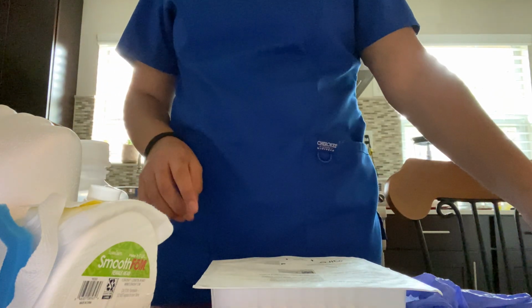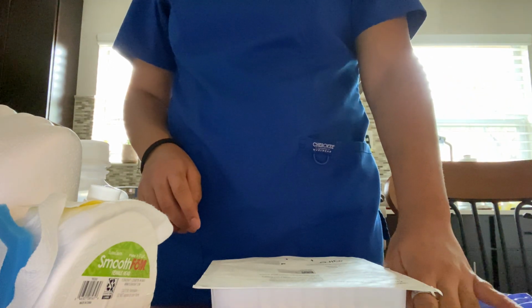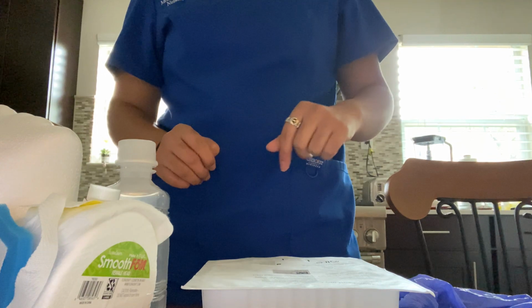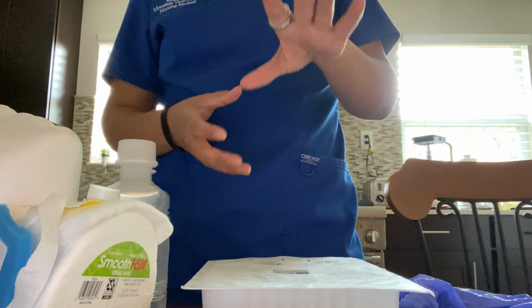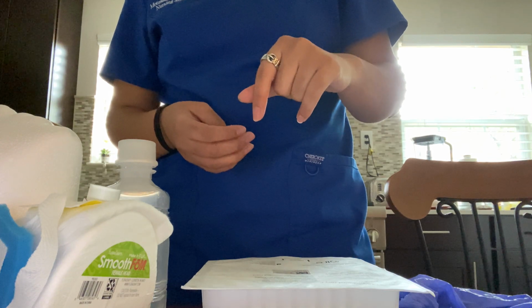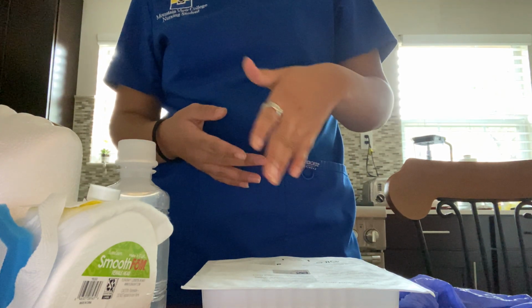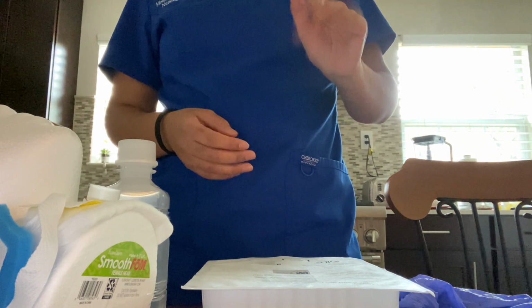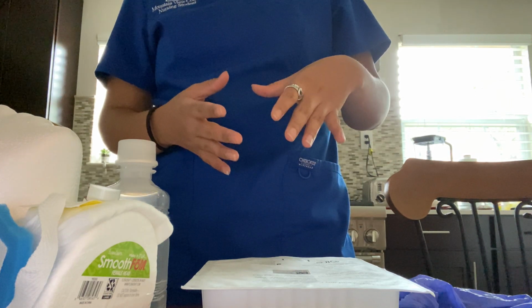And you're also going to want to hyperoxygenate the patient before putting your sterile gloves on. You're just going to get your ambu bag and give like 5 to 6 breaths over 30 seconds, and that will hyperoxygenate them while you're doing your suctioning. So you're going to put on your sterile gloves while maintaining the sterility the whole time.